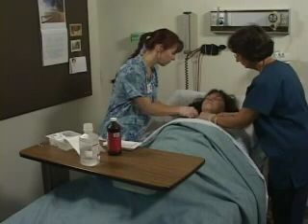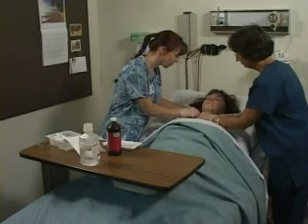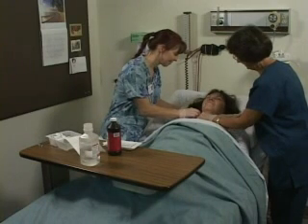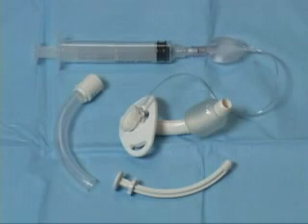It is preferred that a second person be available to assist with changing the ties on the tracheostomy, only because there should be no opportunity for it to be dislodged. An obturator is kept at the head of the bed to place in the tracheostomy opening in the event the outer cannula of the tracheostomy tube comes out. As this is an emergency situation, it should be avoided by having the second person with you for the brief time it takes to change the ties.